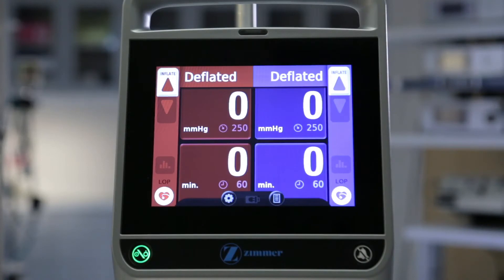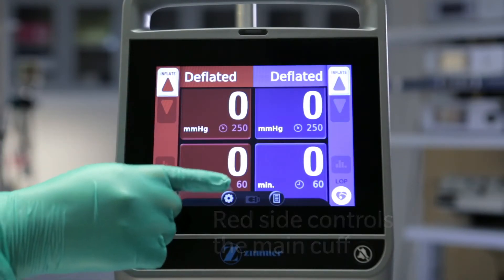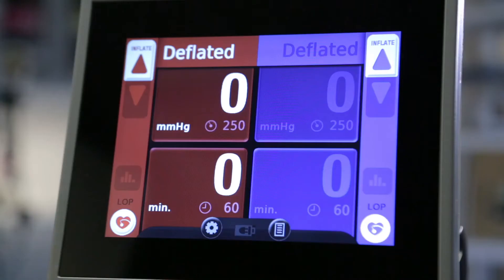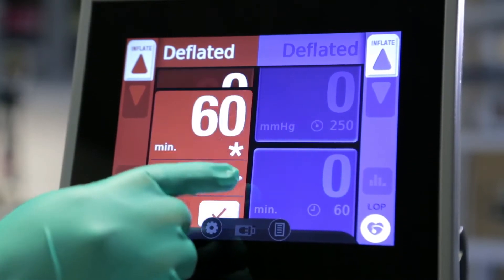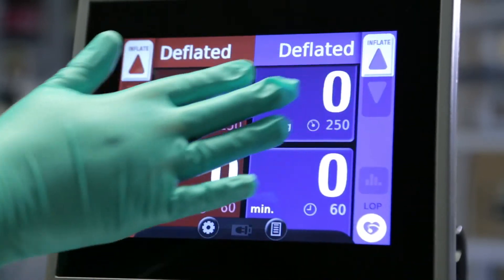The ATS 4000 touchscreen has two sides. The red side controls the main cuff, while the blue side controls the second cuff. The cuff connector ports are color-coded to match the corresponding screens. To prevent potential accidental changes, the ATS screen requires intentional one-finger touches. Brushing, multi-finger, or palm touches will not activate the display.